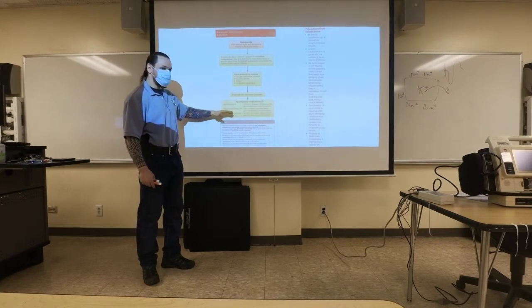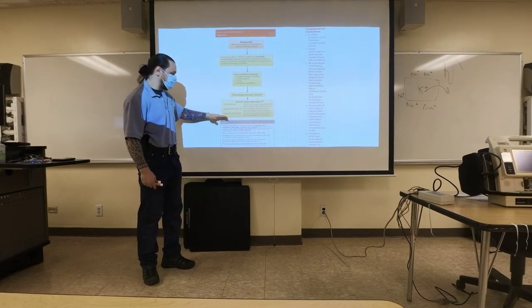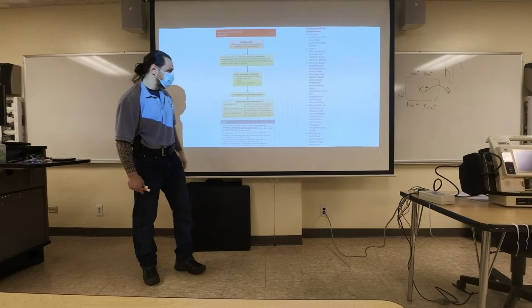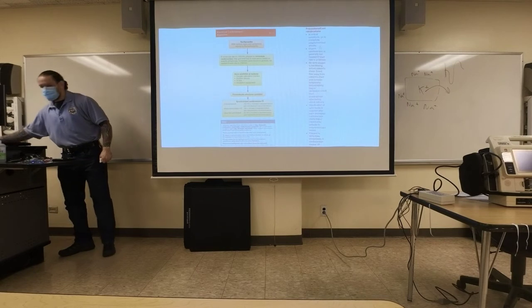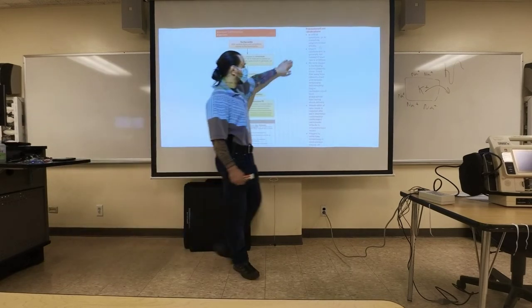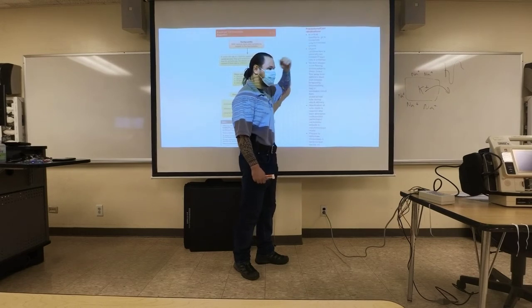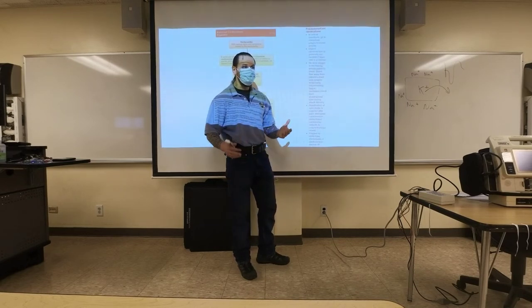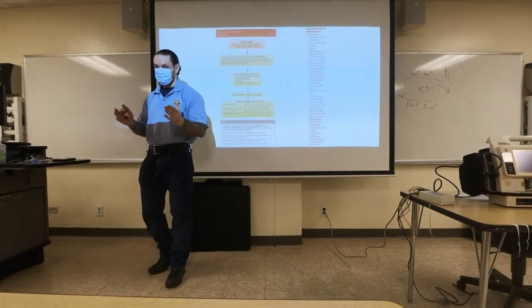Here, it's not like your protocol of 100, 200, 300. They give you different energy selections for if it's atrial in nature versus ventricular. When we get to the ACLS, you'll learn about this. For now, I'm not holding you responsible for this. Something else they list here: if a patient is critical and you have a problem doing synchronized, you're going to go to unsynchronized shocks. The reason they added this point is that sometimes you're in a hospital setting or you're not sure how to use your equipment to do the synchronized cardioversion, so they just say go straight to defibrillation for those patients. But hopefully you guys know how to do it.